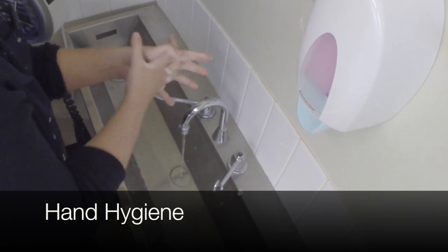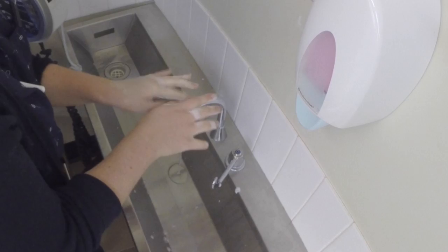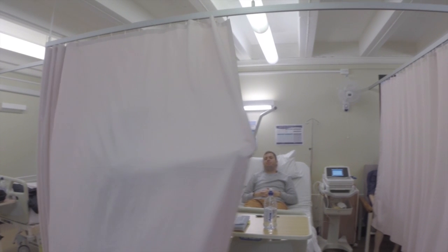Now it's time to perform hand hygiene. Hand hygiene is an infection control technique which minimizes cross-contamination. Providing privacy is imperative to preserve patient dignity because the patient's chest will be exposed during this procedure.